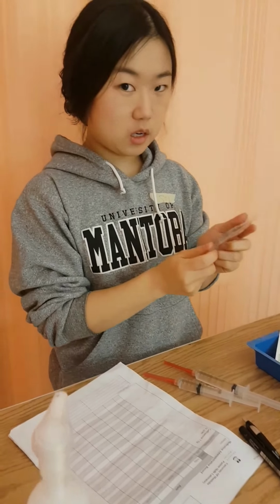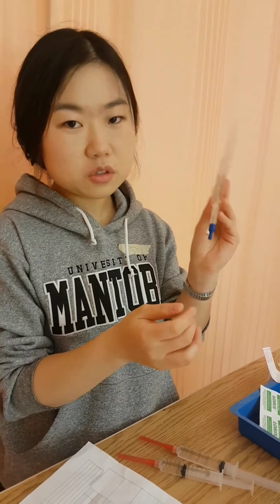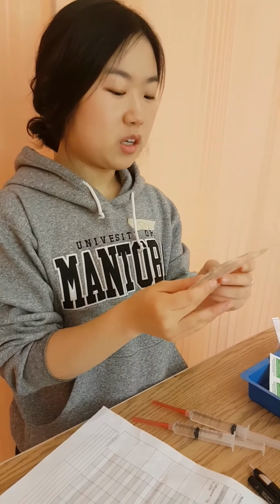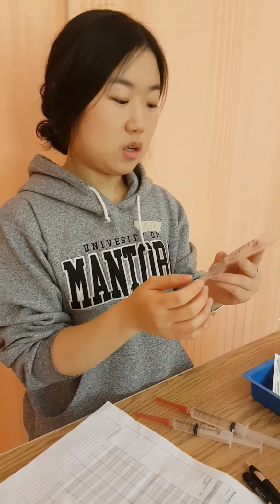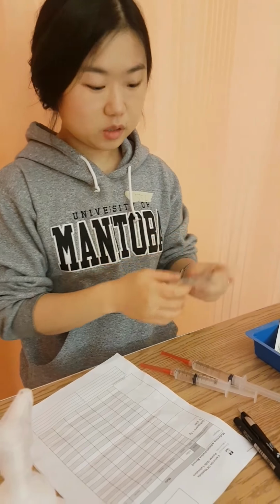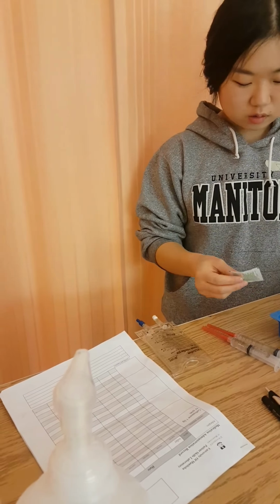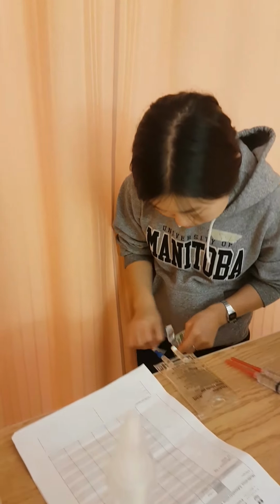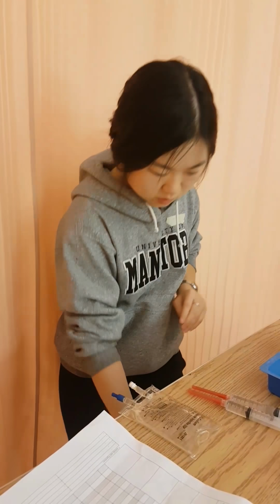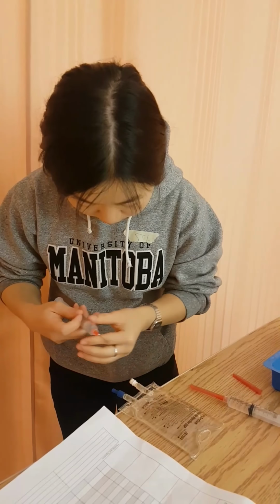So I've got my mini bag here. I'm checking for its patency. There's no tears or holes, and there's no particles in the solution, and I can see that it hasn't expired yet. And I'm also checking if this is the right mini bag. So it's 0.9% NaCl, and it's 50 milliliters, so it's the correct one. I'm going to put it at the edge so I don't break sterility. I'm going to alcohol swab the port for 30 seconds and then let it dry for 15. And then I'm going to dilute my medication into this bag.